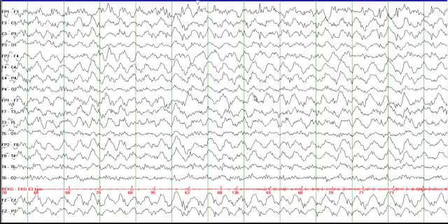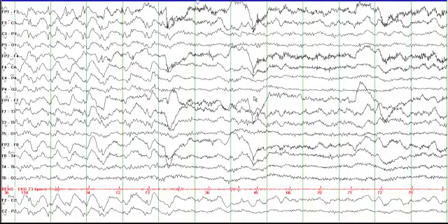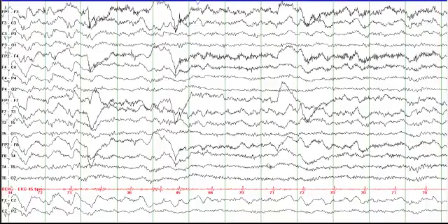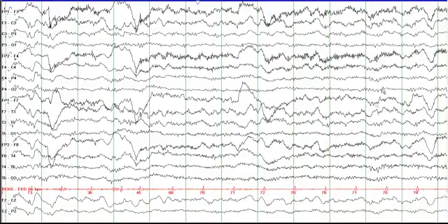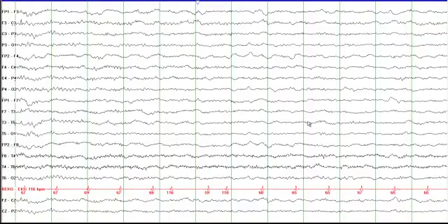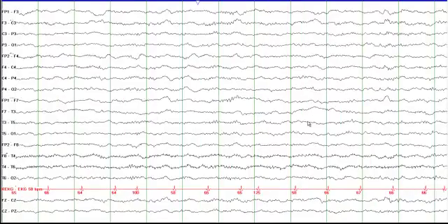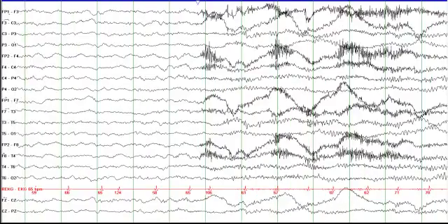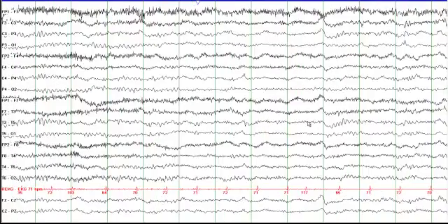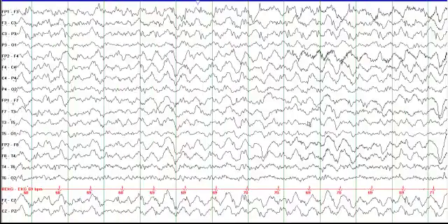At this time the patient had a decreased level of consciousness with no obvious motor activity. This then subsides — you can see it is all gone. There is still some slowing but not the same kind of evolution, and the EEG now just shows slowing. This pattern keeps going on and on.